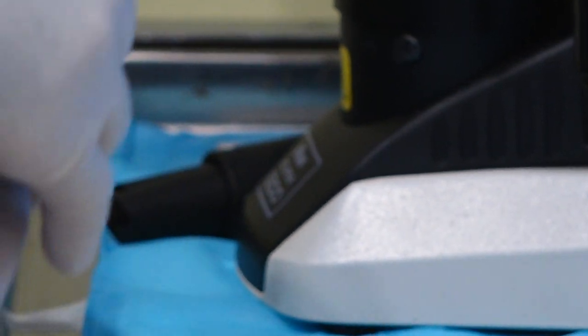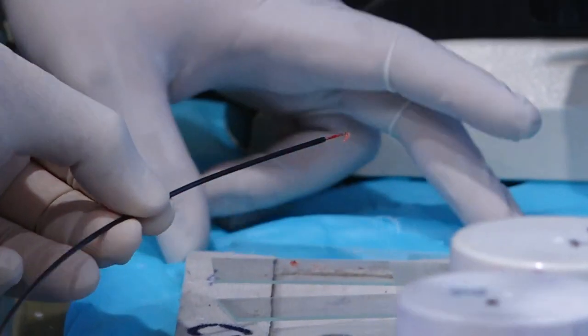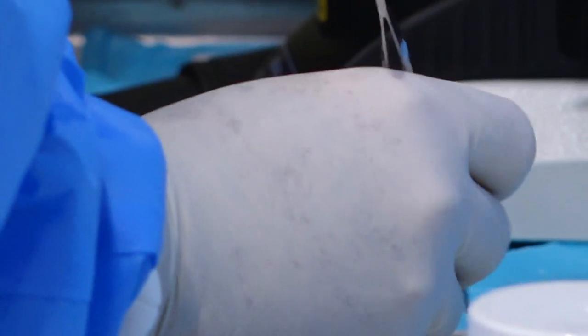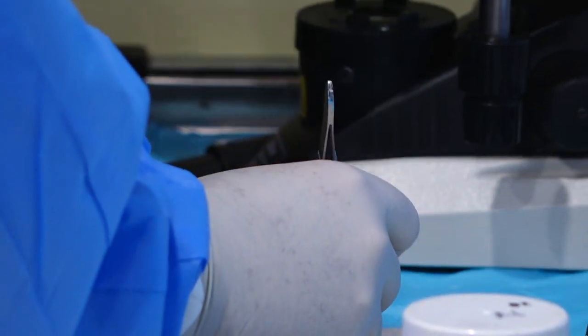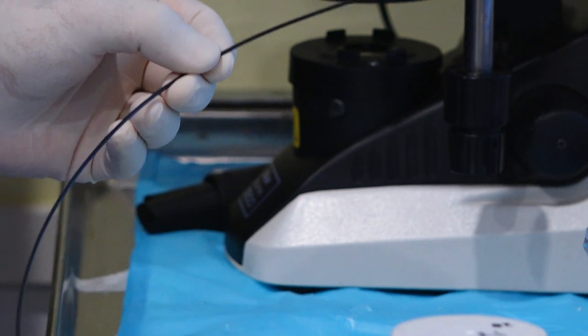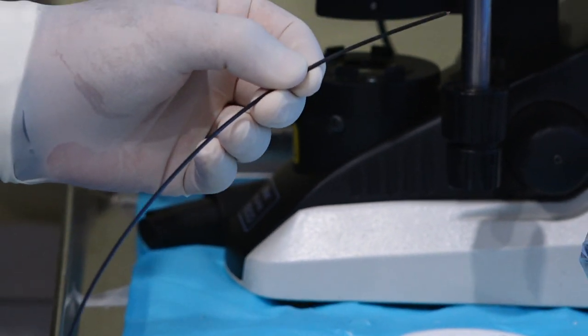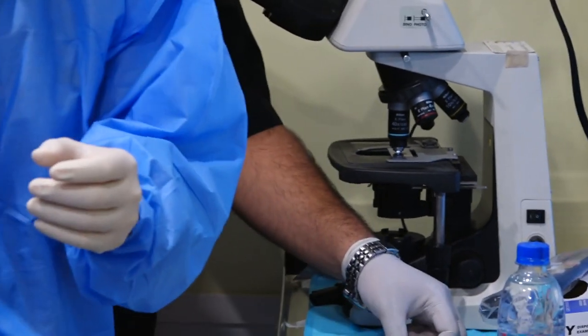So Wasim here has done a great job of exposing the cores. Here we have some more that's present. I'm just going to take a set of forceps and pull the tissue out, ideally without touching the needle. Once we're happy with that, we cap the needle. So we cap the needle and we prepare it for another FNB.